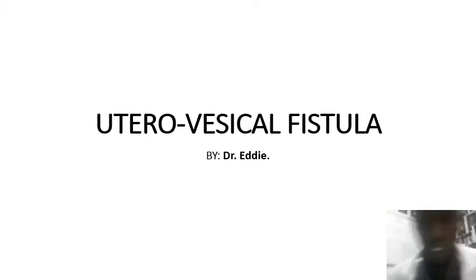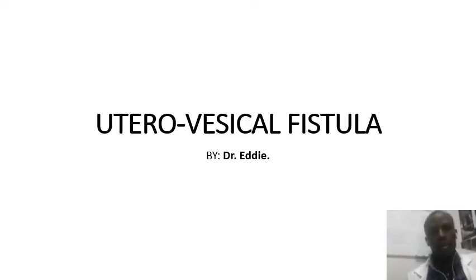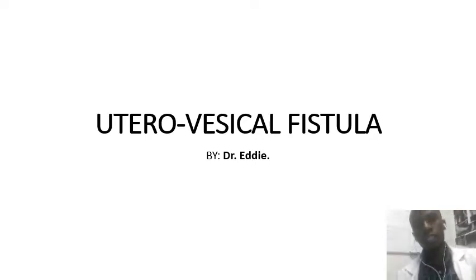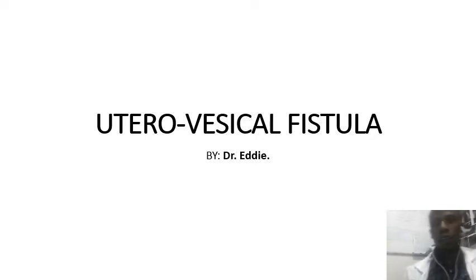Right, once again, we are going to have this presentation about utero-vesical fistula. It is always a challenge to a variety of mothers. They are predisposed to various fistulas, and among them we have this utero-vesical fistula.